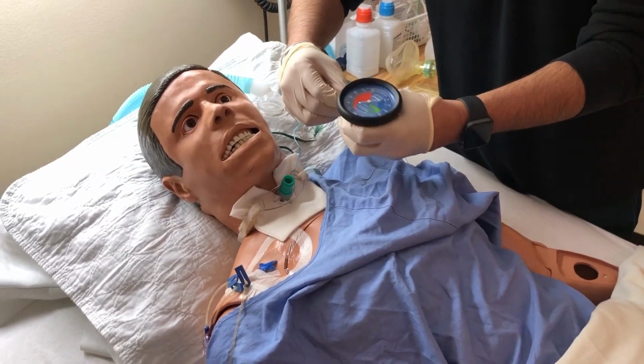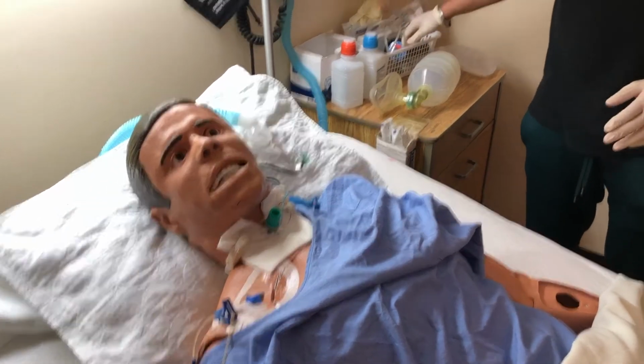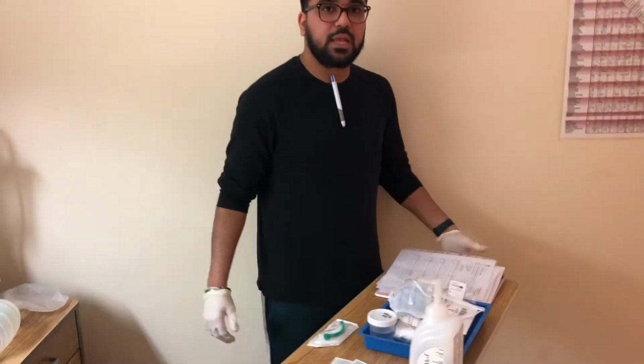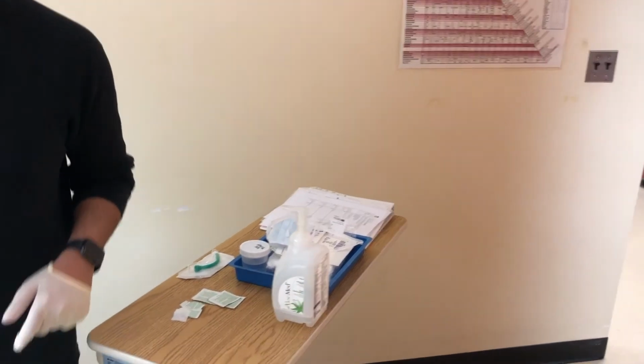Should I get April? I'm just gonna put on standby. Okay. So cuff pressure is checked there. We can put this back in our bin. Okay, April, we're just gonna get the teacher because the pump is beeping. Okay, there's no teacher available, but there's 20 minutes left, guys. Okay, we can just leave it.